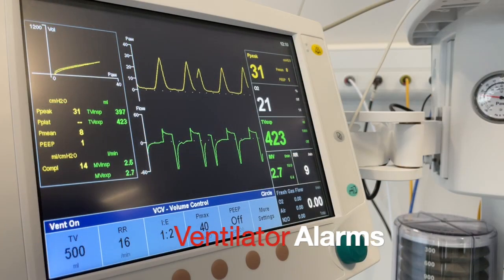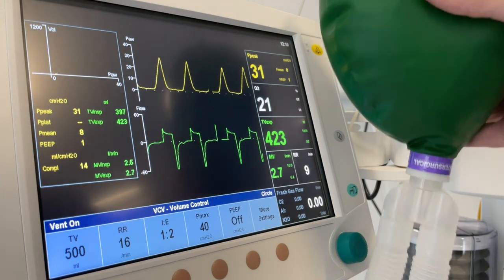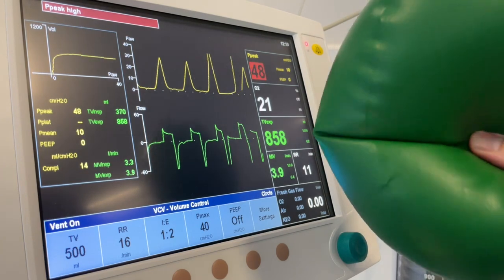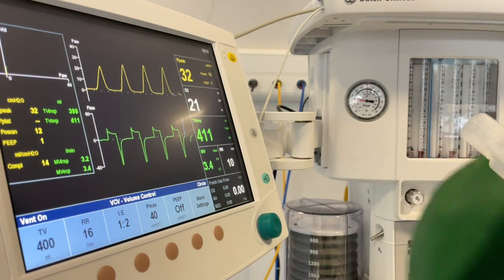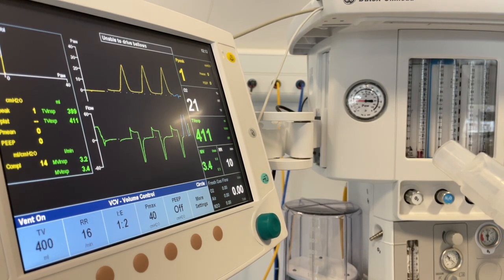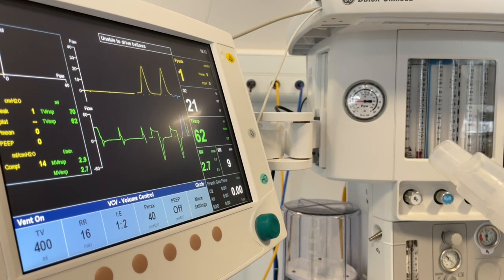The ventilator will have a high pressure alarm and a low pressure or disconnect alarm. To test the high pressure alarm, squeeze the patient bag as the bellows are delivering a breath. To test the low pressure alarm, simply disconnect the patient bag. The ventilator will attempt to deliver a few breaths and then the alarm should sound.